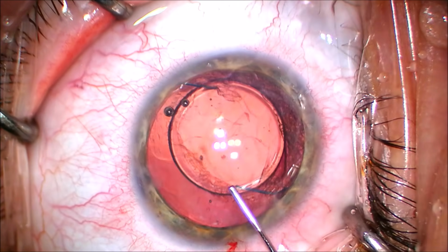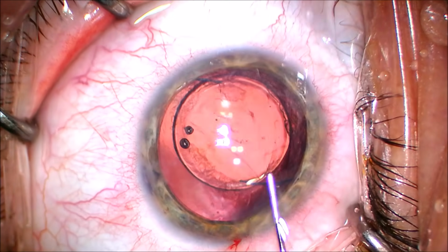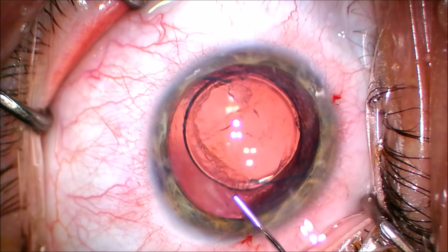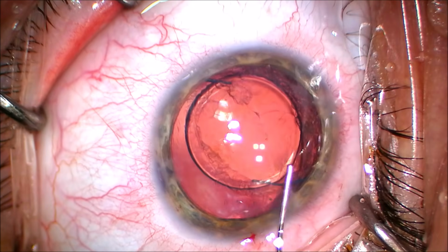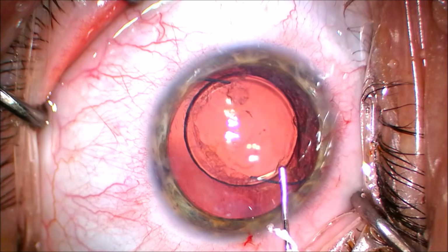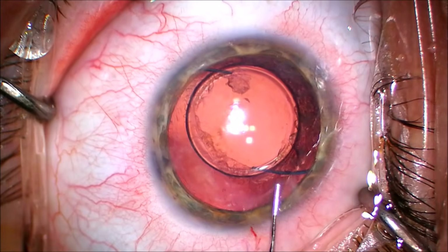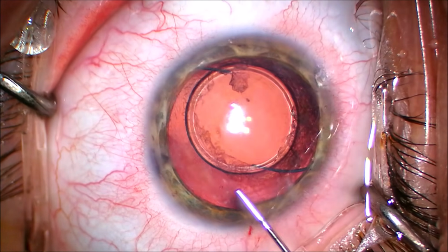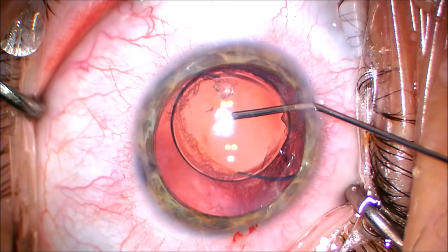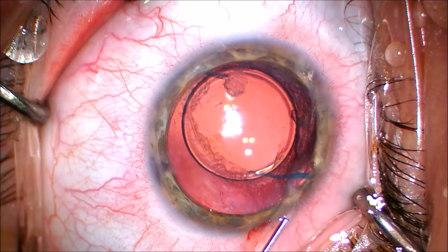I start to irrigate manually the dispersive viscoelastic. I do not think it's a good idea to try to use mechanical IA in this situation. You don't want to overpressurize the anterior chamber and then push a pressure head of fluid into the posterior segment, which would just then invite vitreous forward. Just making sure that the lens is still in optic capture configuration, and then I'm hydrating my incisions.